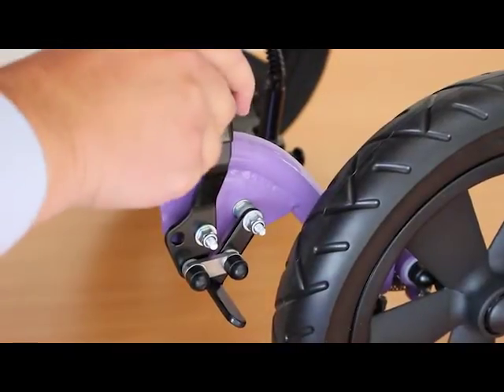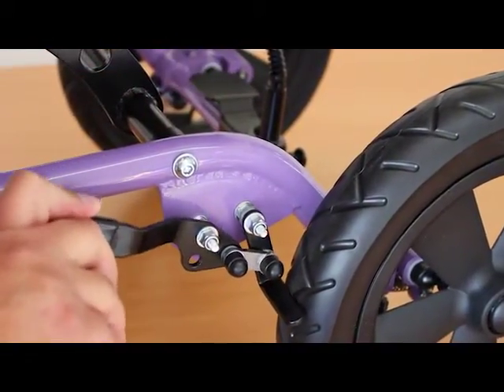The Corgi Sprint has a very simple brake operation, which moves the lever in to lock against the wheel.